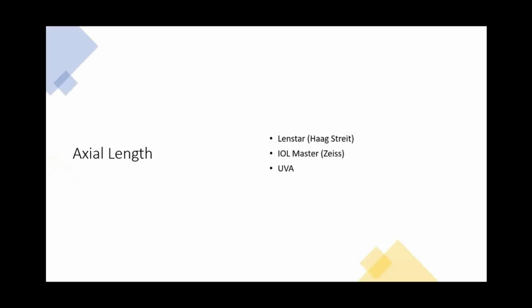So in our clinic, we mostly use the Lenstar. However, other modalities are available as well, such as the IOLMaster or A-scans. As long as it is able to quantify the length of the eye, moving forward, you are able to use this measurement to decide if the treatment has been successful.